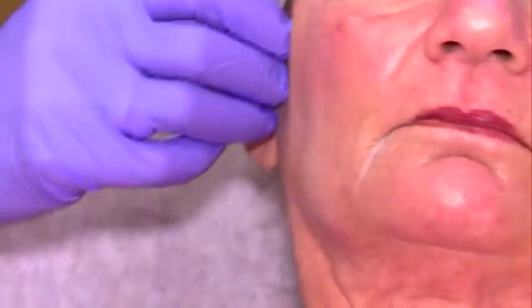This one. So the cannula I've been using, I brought them from Germany, is TSK 22G. It's very short and it's very stiff. Why do I use it? Because I do not want the cannula to bend away. Because it's a matter of precision. I want to see where I am with my cannula to give a precise injection. And that's why I prefer a short but quite stiff cannula. Okay? And can you put this?